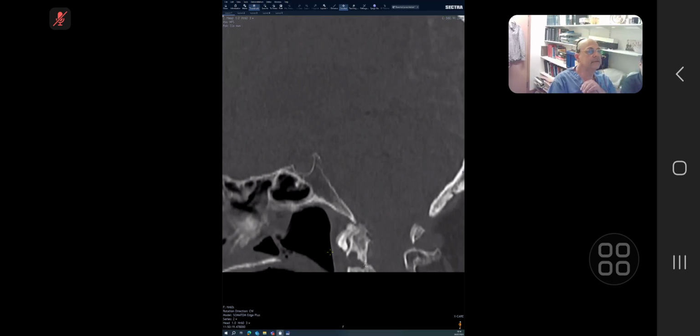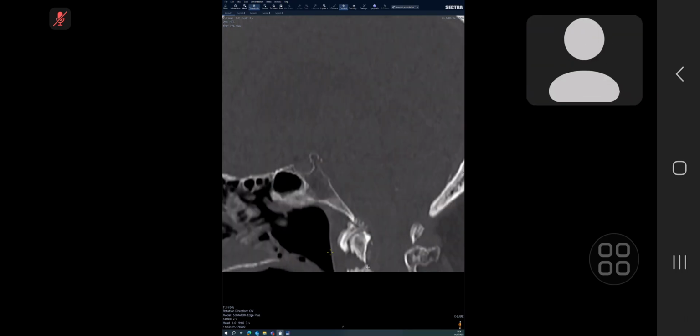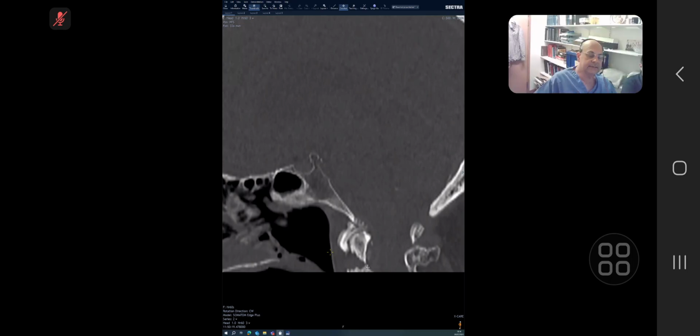What would you do further? I'd like to go for an MR scan to see the status of the cord. You would want to see the CT scan of the cervical spine, and then you would ask for an MR. Remember, MR is to look at the bone edema and ligamentous injury. You would see the bones with the CT scan. This is an old patient, and on table, getting a CT scan is much easier.